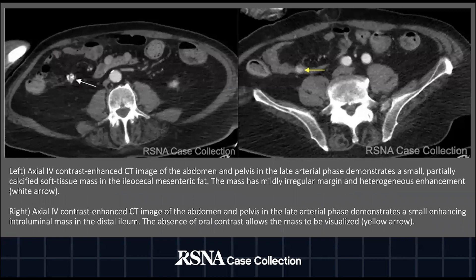On the left, an axial IV contrast-enhanced CT image of the abdomen and pelvis in the late arterial phase demonstrates a small partially calcified soft tissue mass in the ileocecal mesenteric fat, labeled by the white arrow. On the right image, there is an enhancing intraluminal mass in the distal ileum labeled by the yellow arrow. The absence of oral contrast allows this intraluminal mass to be visualized.